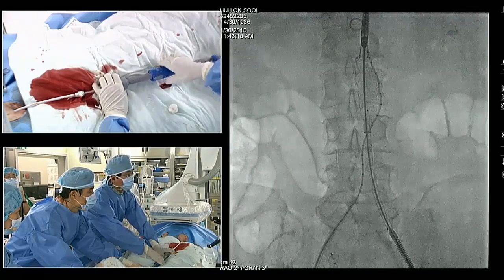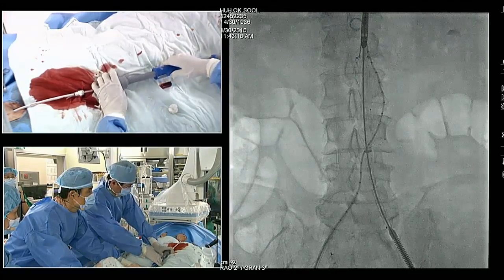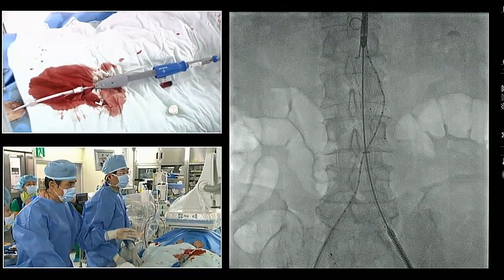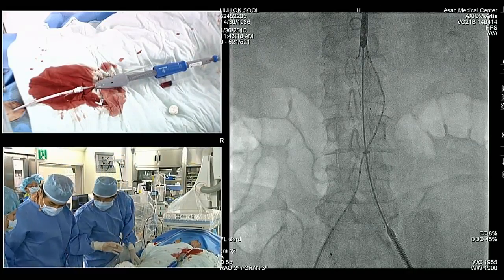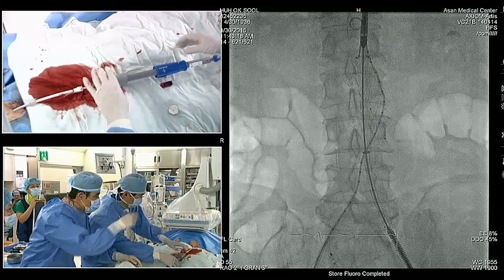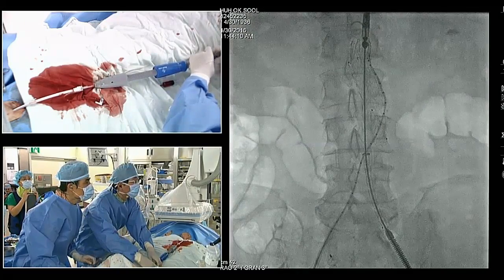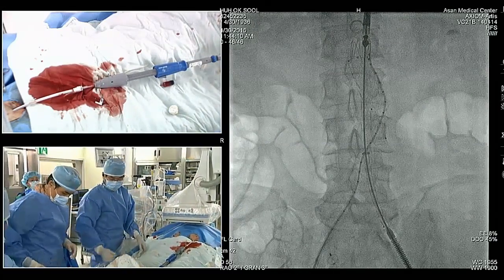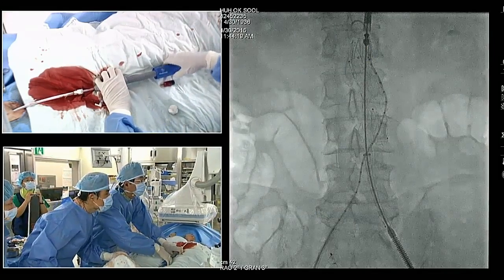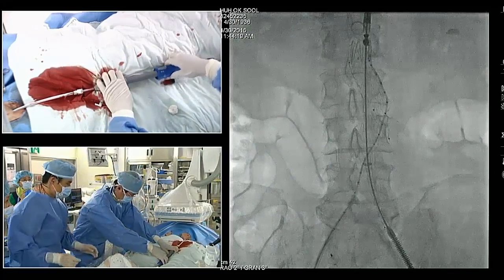Another problem is that the left common iliac artery was small in diameter with circumferential calcification. We can see that on the transverse CT image. I don't think it matters so much, since you need to extend on the right side anyway to the external iliac. You could put the main body up there and then pick your extension to go into the external. And then on the left side, you have more freedom to pick an iliac extension limb to be certain that you don't cover the internal.